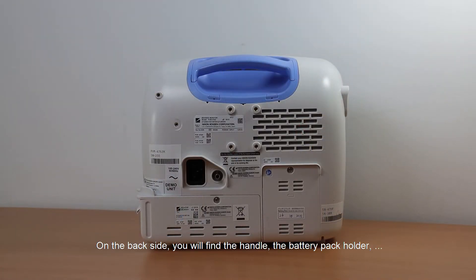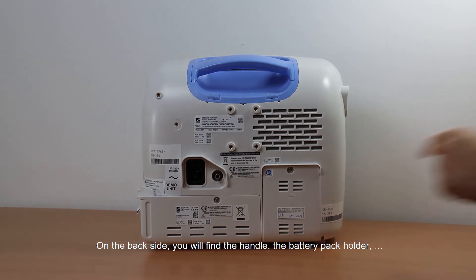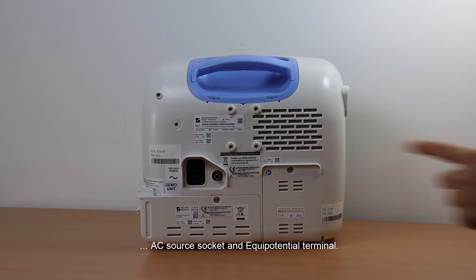On the back side, you will find the handle, the battery pack holder, AC source socket, and equipotential terminal.